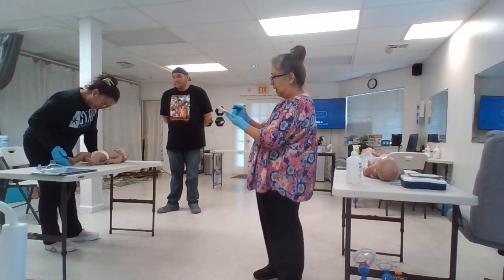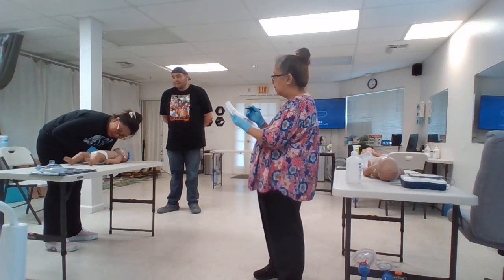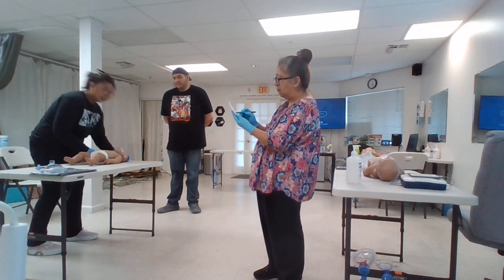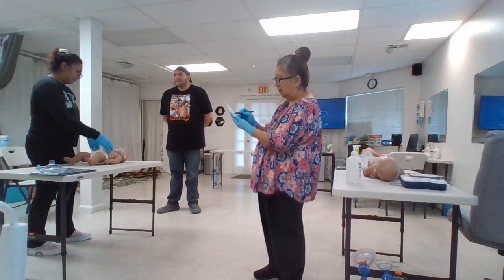Hey, are you okay? Okay? Baby's not responding. Baby's not breathing, has no pulse. Call 911 and get the AED.